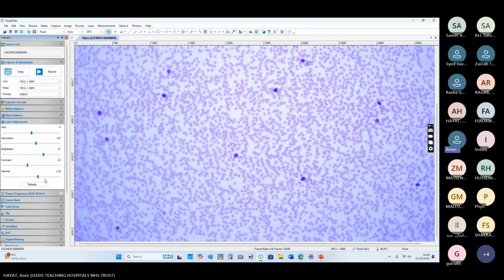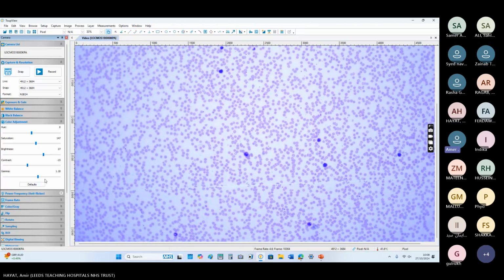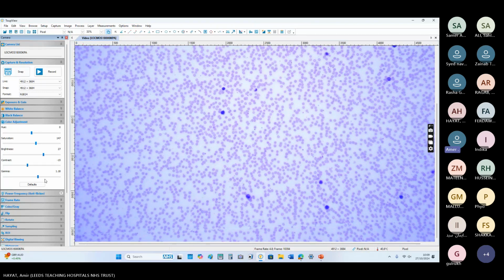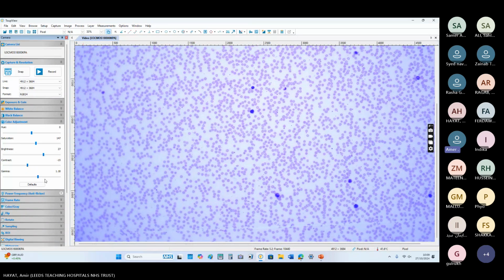He has a previous diagnosis of multiple myeloma and he has been started on non-transplant eligible category chemotherapy, VCD. This is the blood film of the same patient who has come back to you with worsening back pain. The blood test shows AKI stage 2, hypercalcemia and hemoglobin is 90.